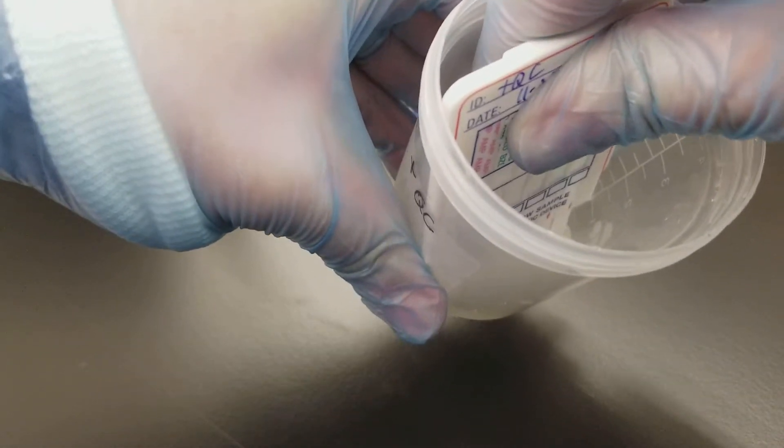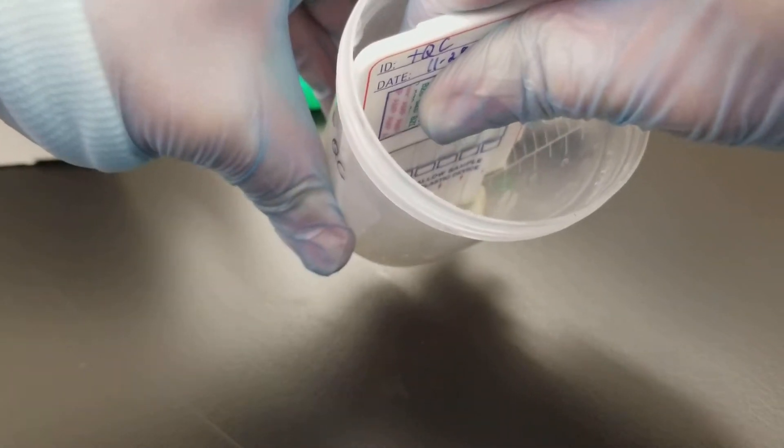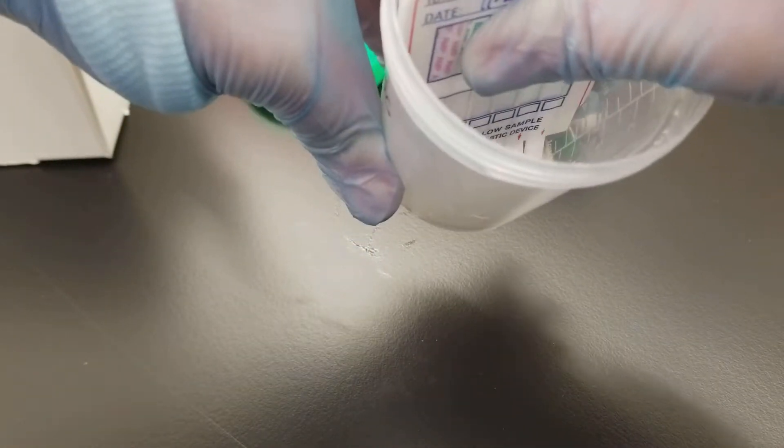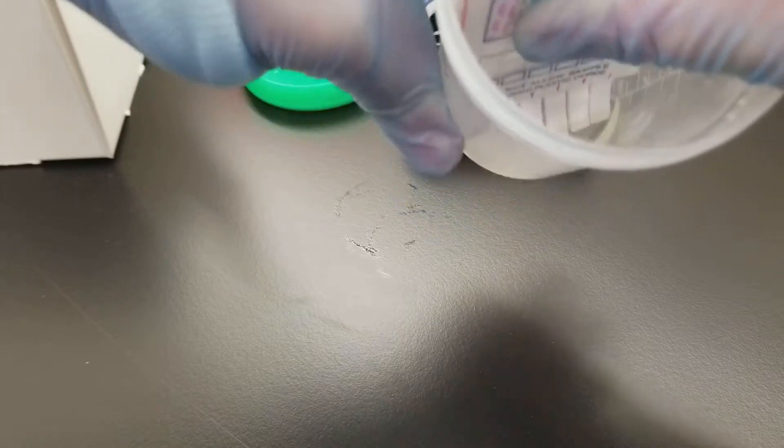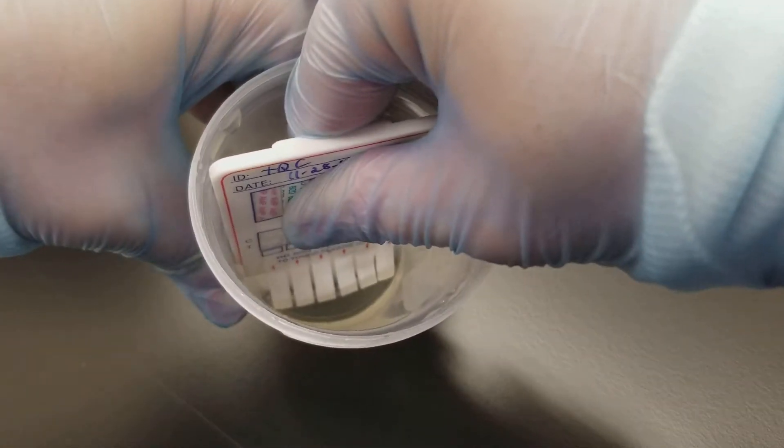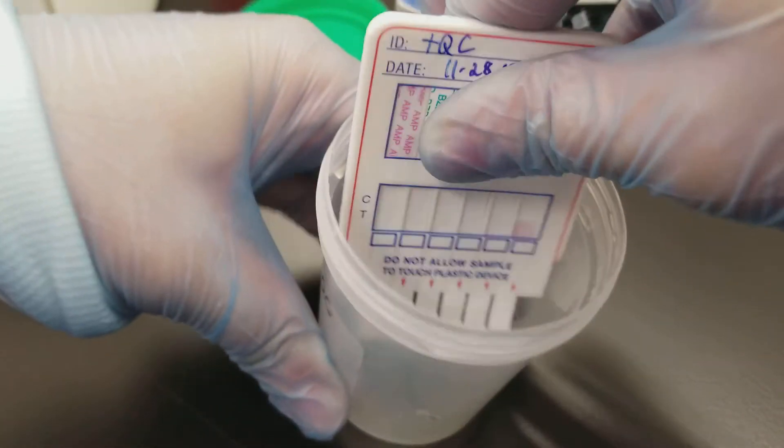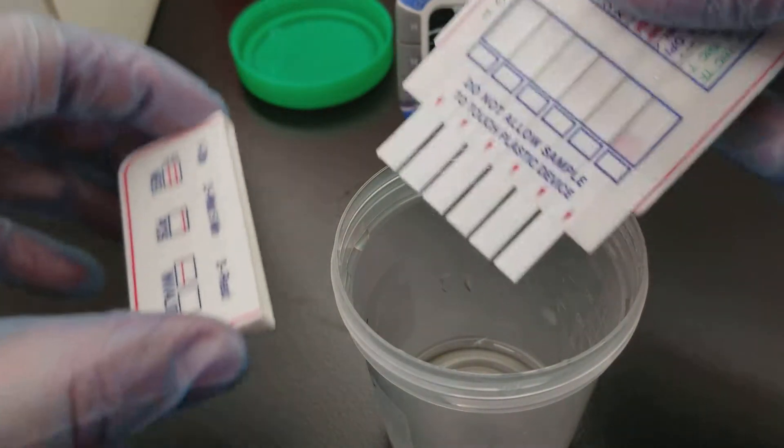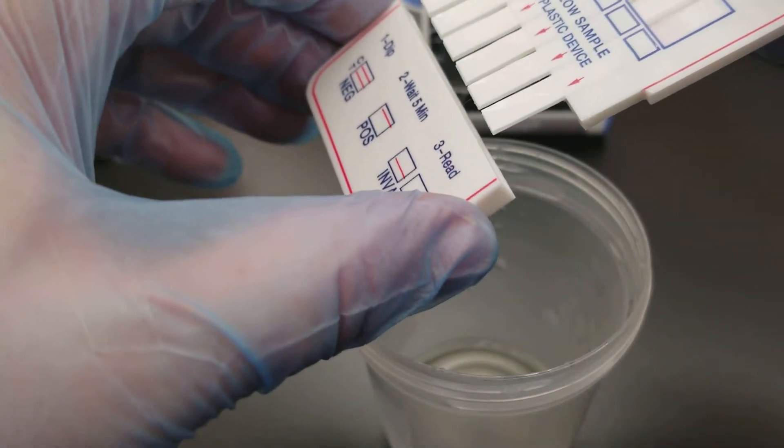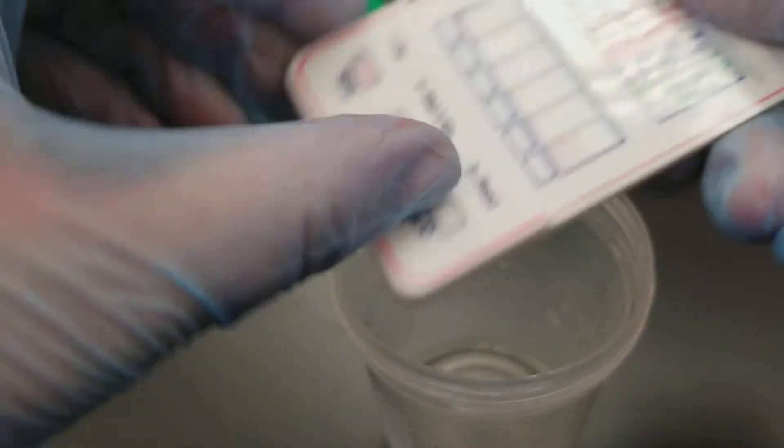Counting: one one-thousand, two one-thousand, three one-thousand, four one-thousand, five one-thousand, six one-thousand, seven one-thousand, eight one-thousand, nine one-thousand, ten one-thousand. I'm going to shake it in there just for a little extra measure. It's okay to bend them a little bit because there was hardly any urine in there. Now I'm going to cover it back up.